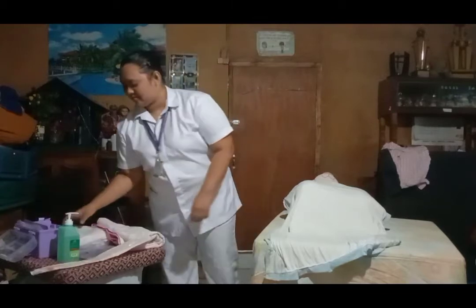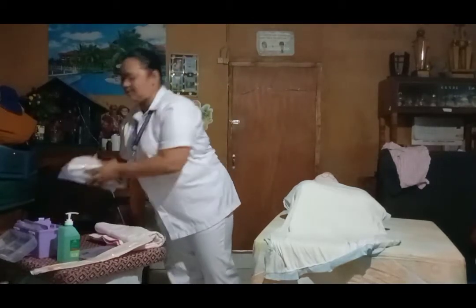Identify the patient and explain the procedure. This is to know if the assigned patient is the right one and so that the patient will know what will be conducted to them. So I have already prepared the necessary equipment that I need in conducting the procedure, and that includes the two-way foley catheter, urinary bag, catheterization set.